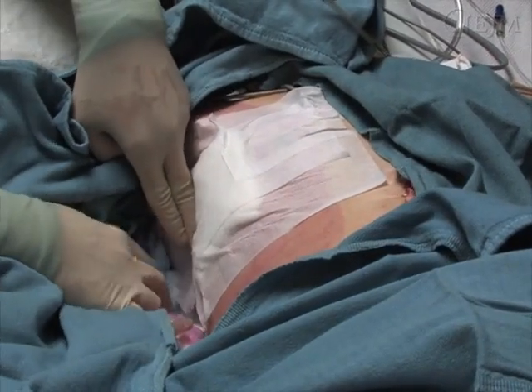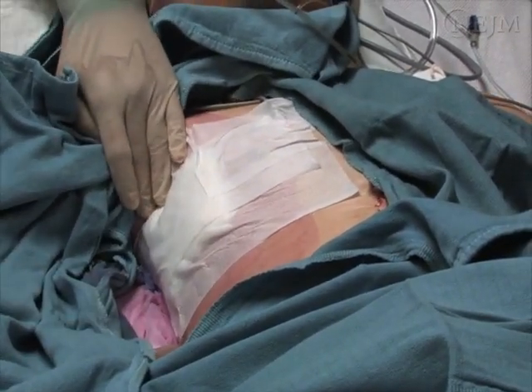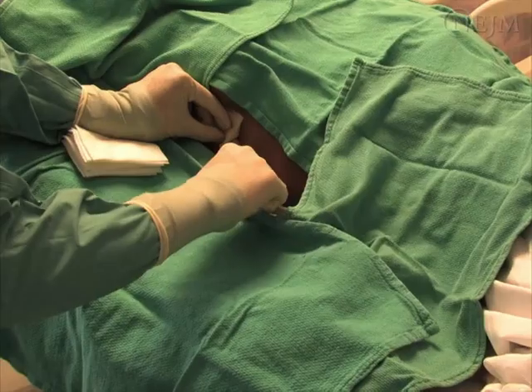Secure the site with a pressure dressing. Additional sutures may be required to close the incision. A follow-up chest X-ray should be obtained 12 to 24 hours after the tube has been removed. Closely inspect for any suggestion of a new pneumothorax.